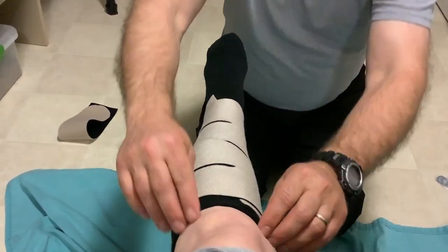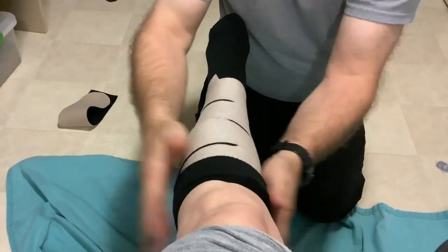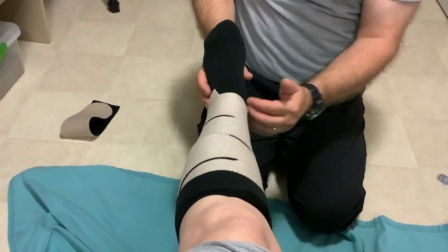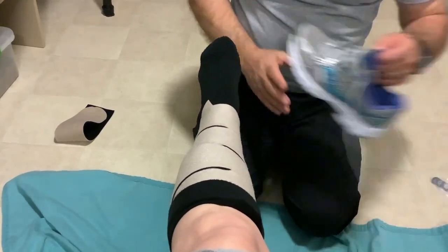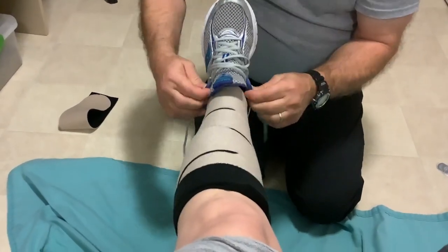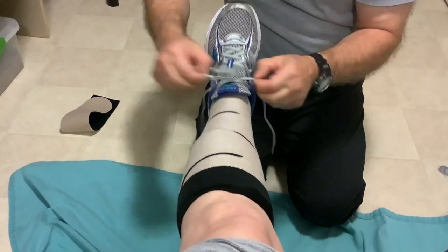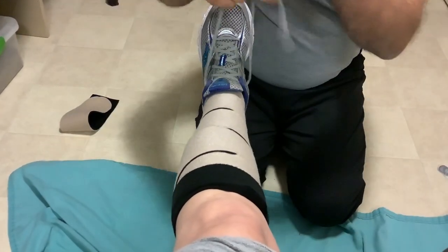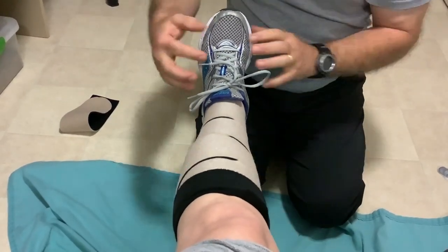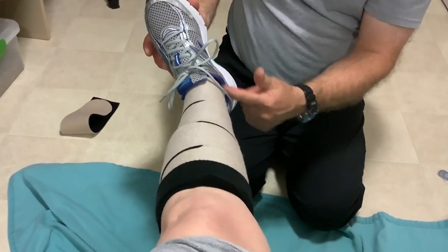Take the top of the sock, pull it way up, and flip it down over the top of the wrap. The important part is that you want good compression all the way down to the ankle, because then you're going to use a shoe. Lace-up shoes are absolutely the best here — the lace-up shoe provides a custom-fit compression on the foot. Just as the day goes on and your leg gets smaller, you can snug the straps and come back to snug the shoelaces as well. It transitions very nicely right into the ankle.